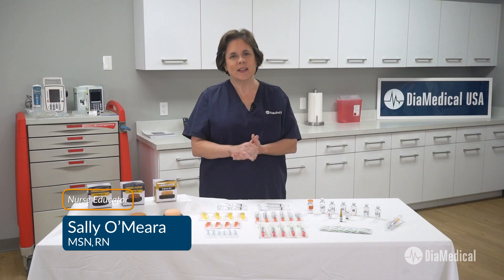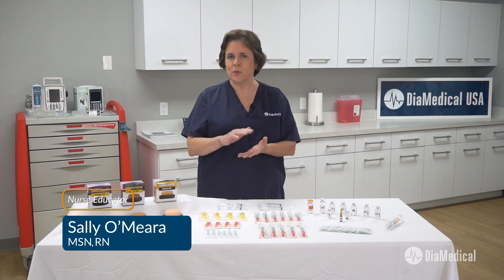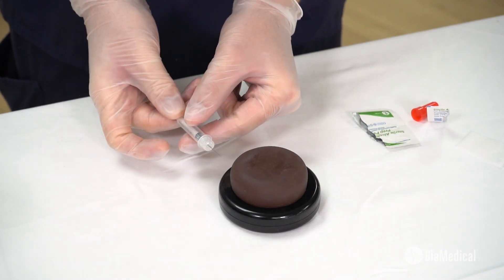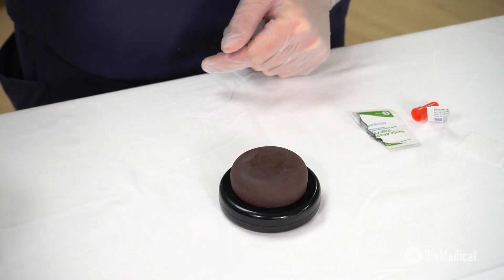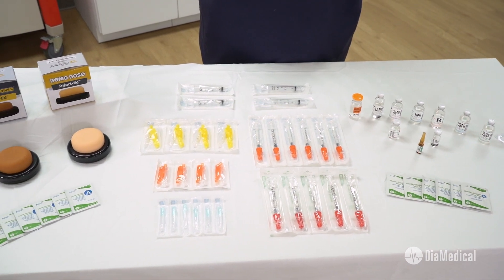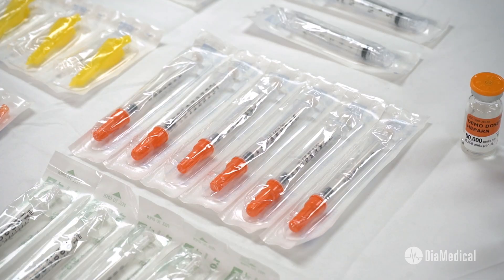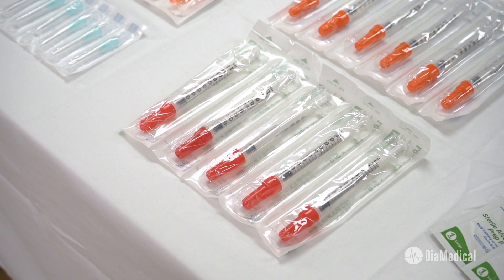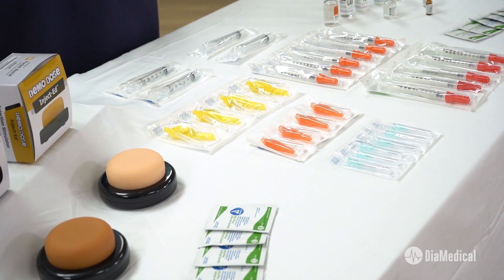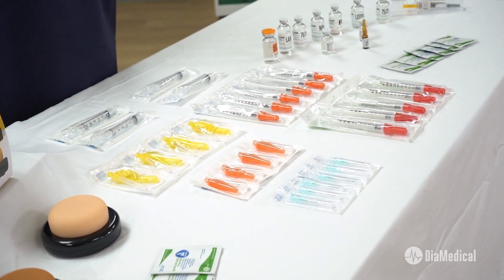Welcome back to Tuesday Teachings. Giving IM, sub-Q, and intradermal injections is a quintessential skill for nurses and medical assistants. In training, they're taught the best practices for injection so that they can protect themselves and their patients from injury. However, it can be difficult for educators to choose the best injection trainers, needles, and syringes for their skills labs. Follow along as I demonstrate some products specifically designed to help educators teach safe injection techniques.